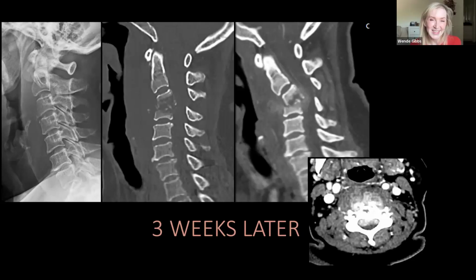And this is another reason I'm showing these pictures. This is a point that I think is a good tip for anybody. I think some prominent radiologists may disagree with me, but I think this works quite well. If you give intravenous contrast in the setting of infection or tumor, you can often see enough to make your surgical plan if you can't get the MRI.